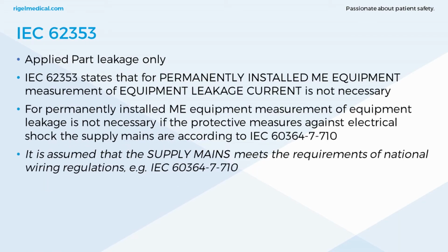Okay, so IEC 62353. Here we only have to do applied part leakage. IEC 62353 states that for permanently installed medical electrical equipment, measurement of equipment leakage current is not necessary. So you only need to do applied part leakage, and this is in the standard. For permanently installed medical electrical equipment, measurement of equipment leakage is not necessary if the protective measures against electrical shock in the supply mains are according to IEC 60364-7-710. And this is a note that's found in IEC 62353.